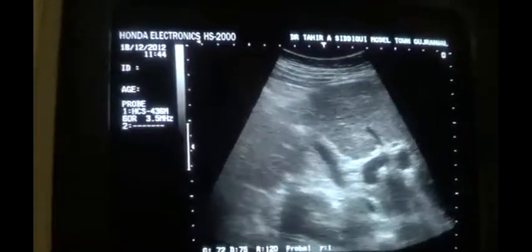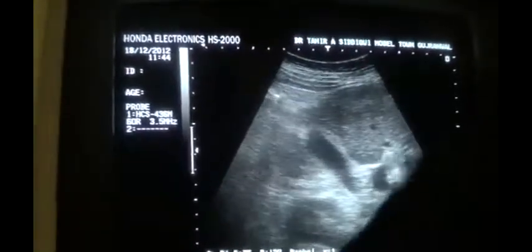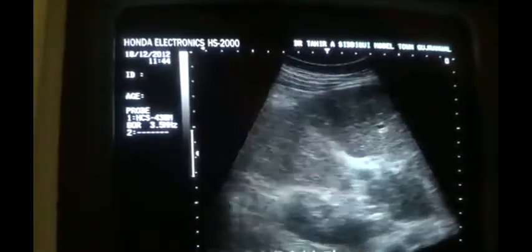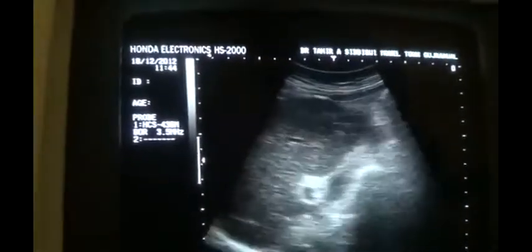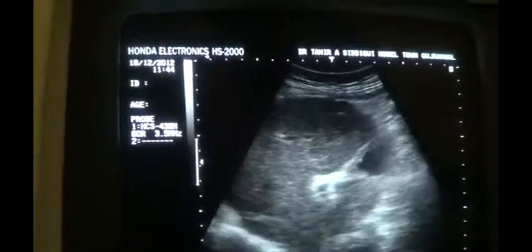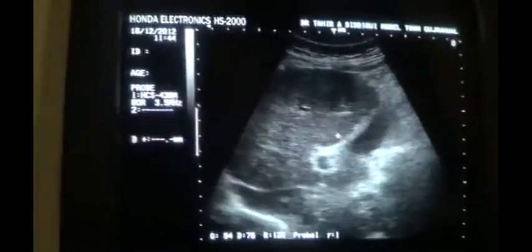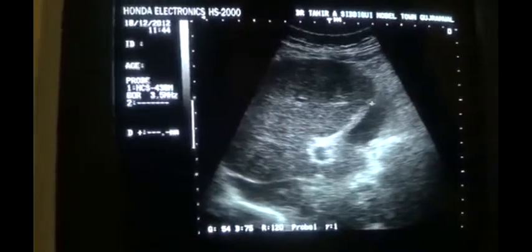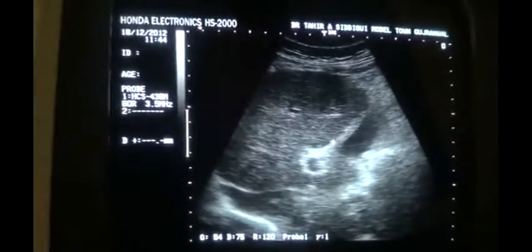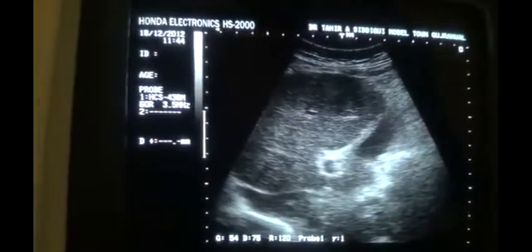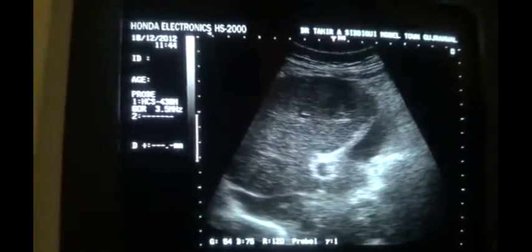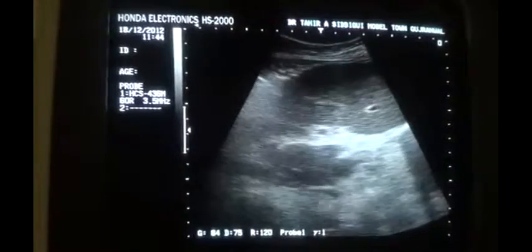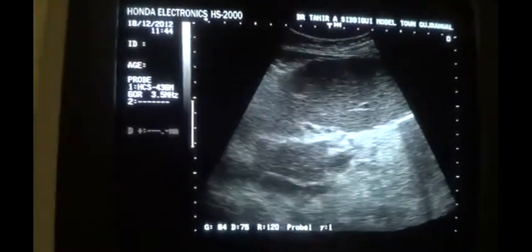Now see the wall of the gallbladder. The gallbladder in itself is normal. The wall appearing thick and more bright is the cause of adjacent liver parenchymal changes.